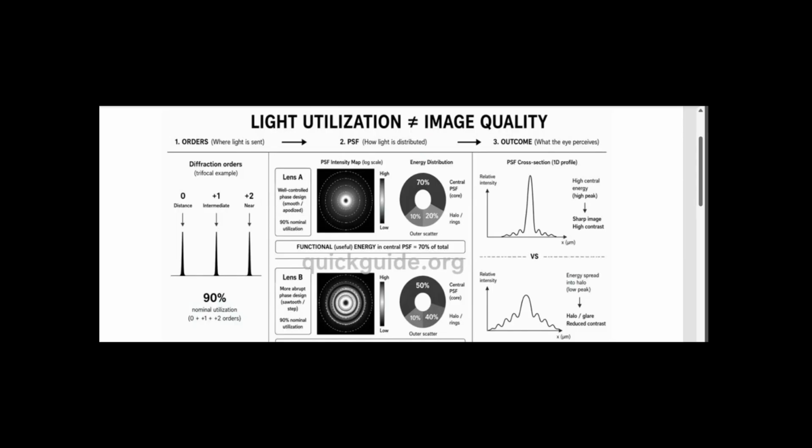Friends, many a time it is a question whether very high light utilization by diffractive multifocal IOLs always leads to better image quality. And to me, the answer is no. You can have very high light utilization, but the image quality may be wanting. Your patients may still suffer from dysphotopsia, halos, and glares.